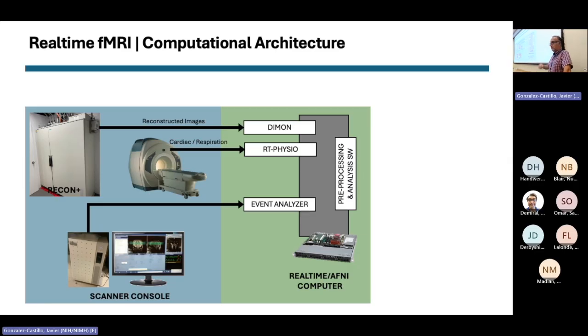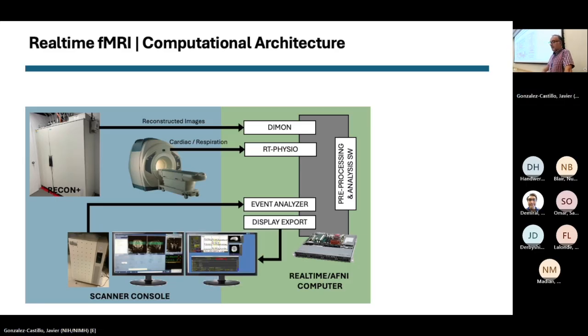When you prescribe, when you start a scan, when you add a scan, you need something that tells this computer that those things are happening, because you want to see what's going on with your data in terms of analysis and all these extra capabilities. What usually happens is that you have a second monitor sitting next to the console one, where you're seeing basically an export of the display of this guy.